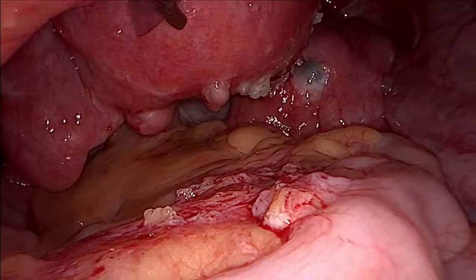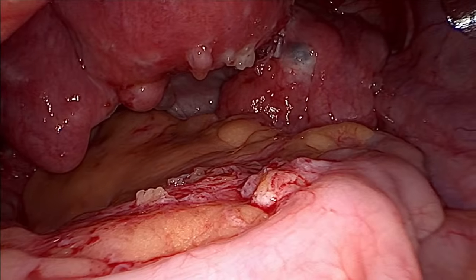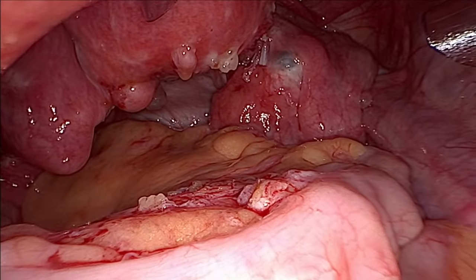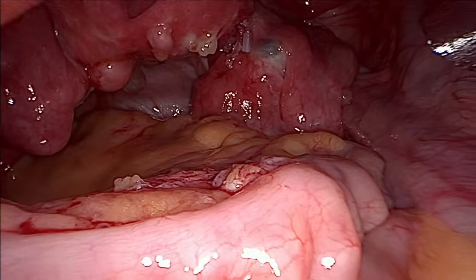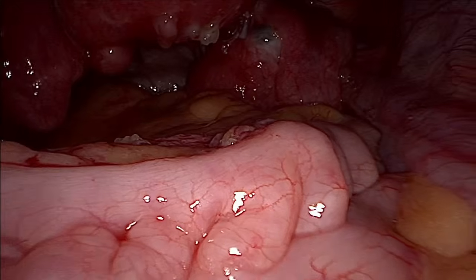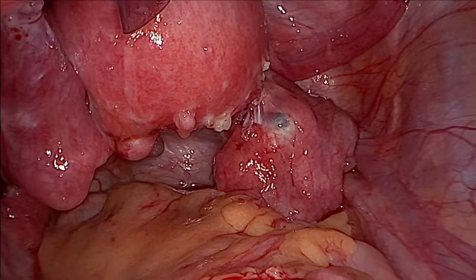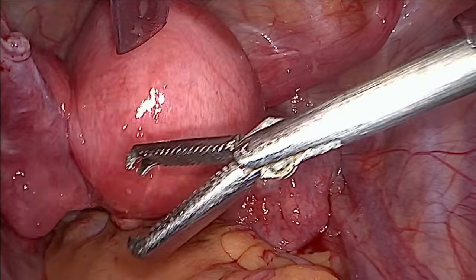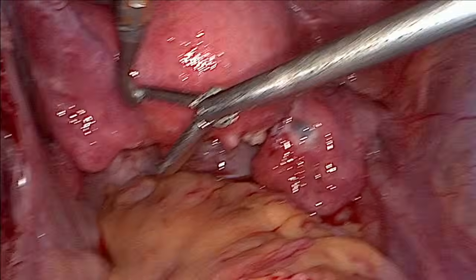There's no gas inside the abdomen. Just a minute. I think that switched off. Okay, we are back with the gas. I think it has been dissolved.